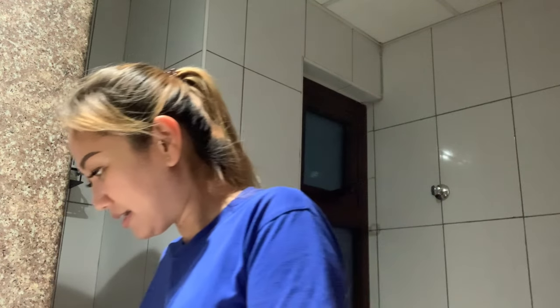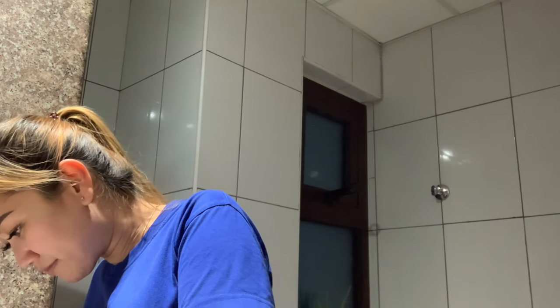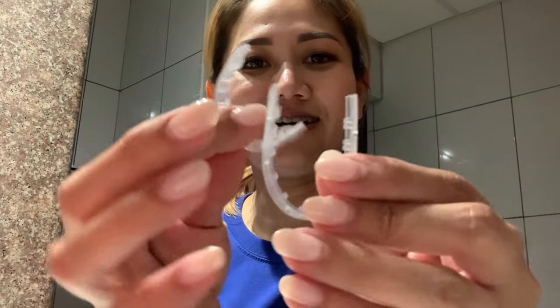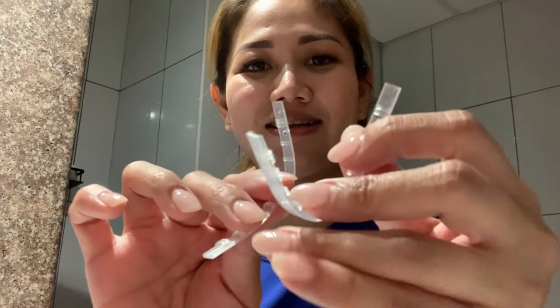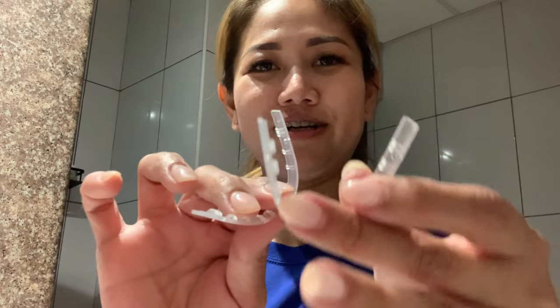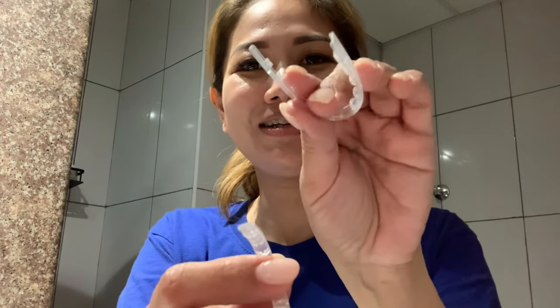Oh, it's really clean. Here it is! You can really notice they have different sizes — the other one is quite longer and the other is shorter. The shorter one is for the lower teeth and the bigger one is for the upper teeth.